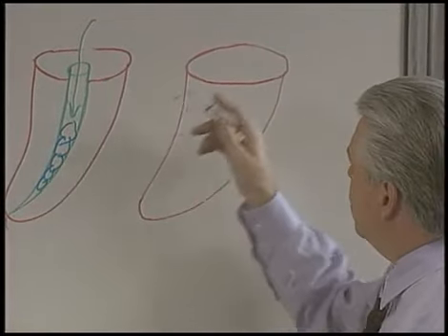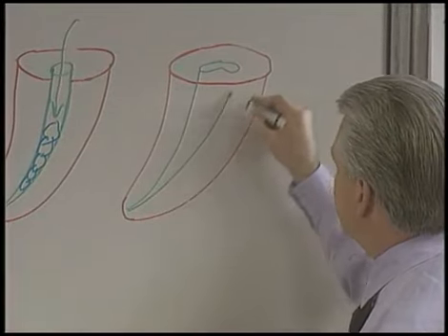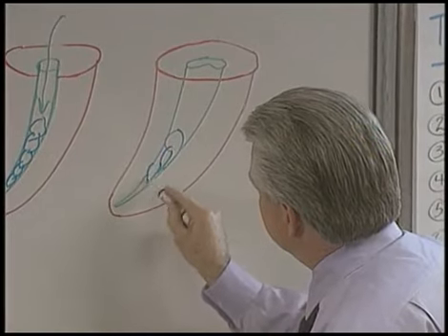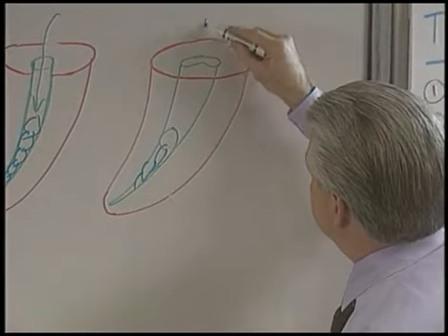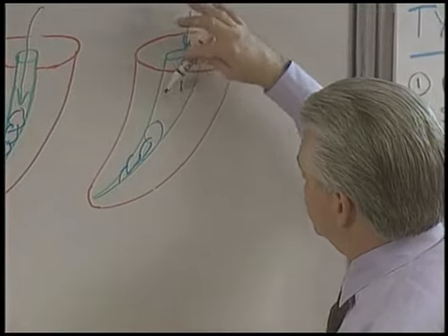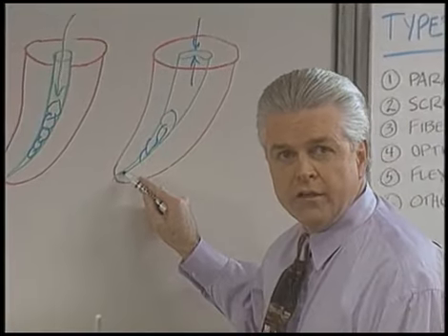However, frequently on molars, canals are irregular in their cross-sectional diameters, and so when an instrument does in fact get separated deep in the root, we have the opportunity to realize the instrument's only binding on a couple points. We can negotiate lateral to the fragment, and frequently we can negotiate the terminus.